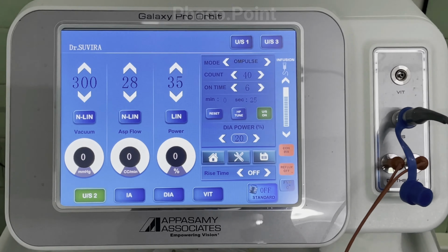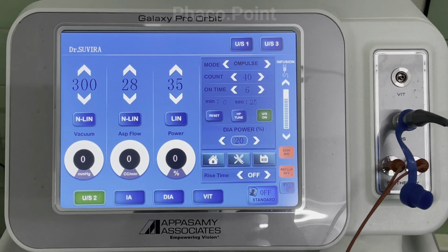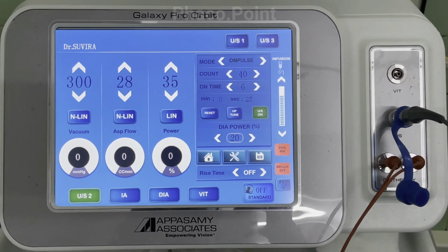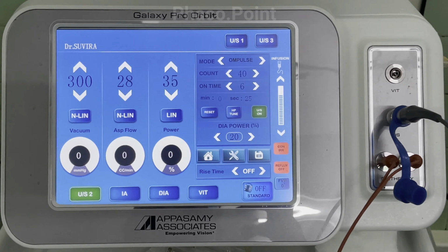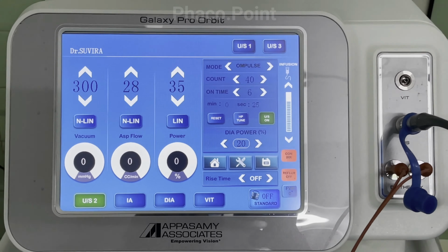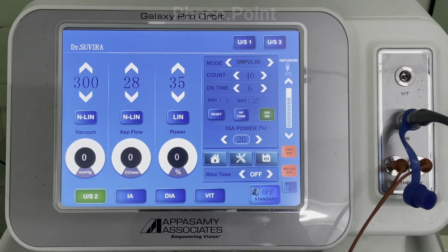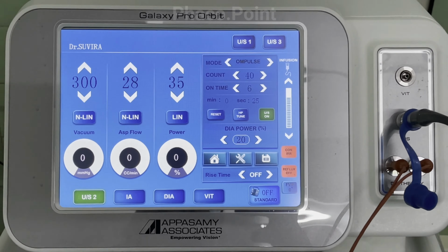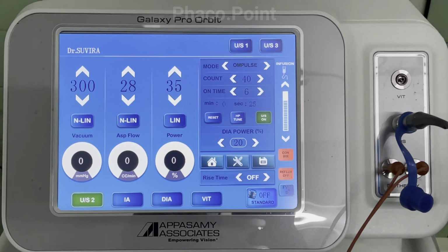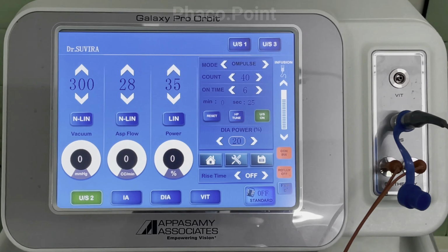It is very important for you to understand your particular machine in your OT, and based on the density of the cataract, what particular power modulation you would choose for this eye so as to minimize the energy delivery into the eye. In this case, we are planning to do the direct chop technique, and the settings are as follows. The vacuum is set at non-linear 300 millimeters of mercury. That is, as soon as you go into foot pedal 3, the vacuum is maintained at 300 from the beginning of foot pedal position 3 all the way down to maximum depression.